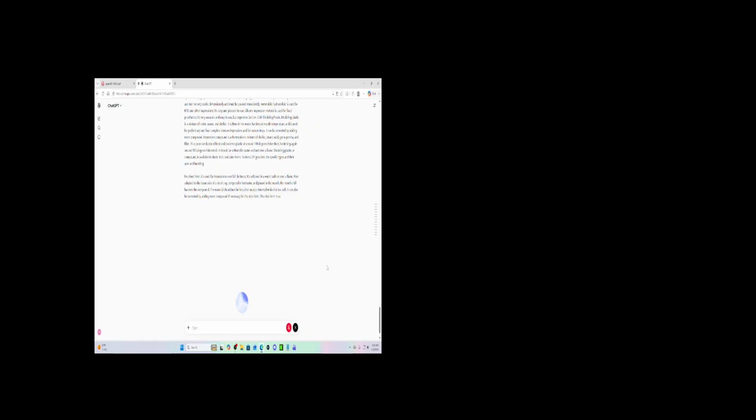For the stick form, it is used to correct or modify sheet compound impressions or to make a border on a special tray. It is softened in a flame, tempered in water, and placed in the mouth. The mouth hardens the compound. The material should not be forced or muscle trimmed while too soft either.